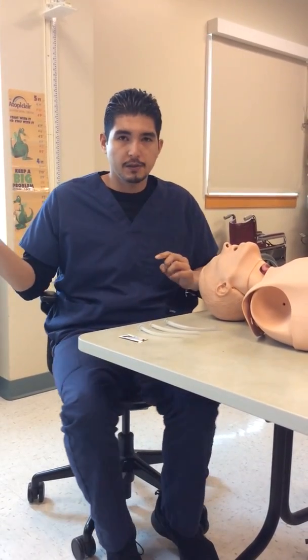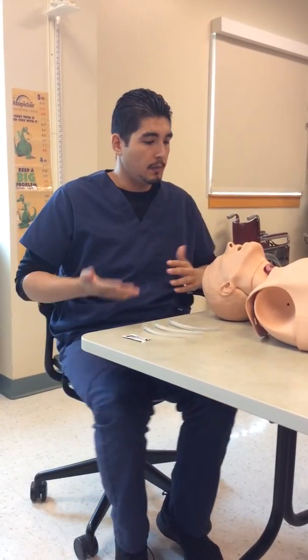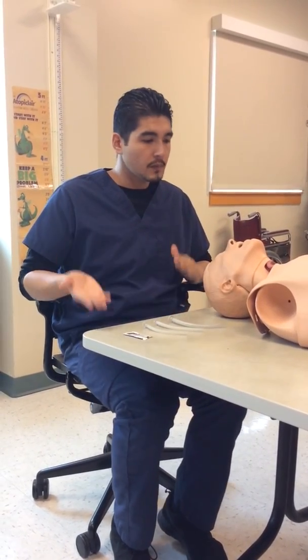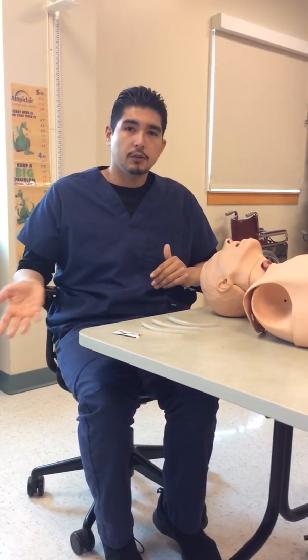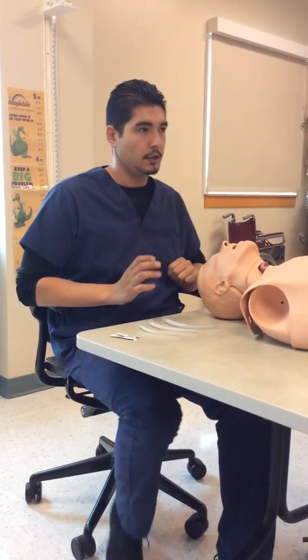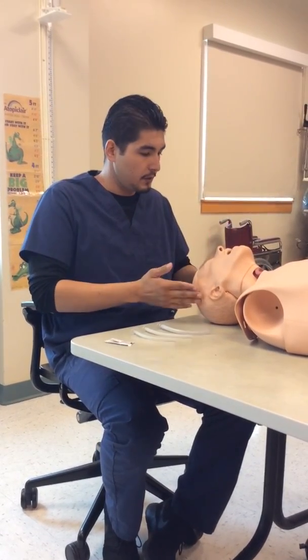And if the patient's family's there, you can also explain to them there shouldn't be any real risks. I'm going to be with you the whole time, and it might be a little bit uncomfortable, but we're going to put some lubricant on there so it feels less uncomfortable. Once you got the patient's consent, then you're ready to begin.